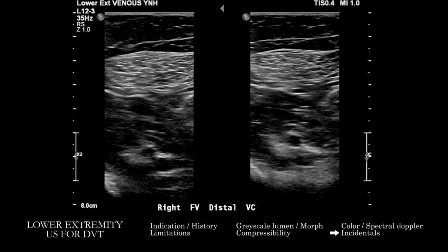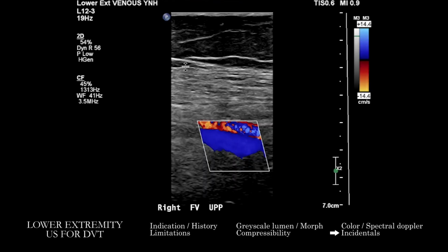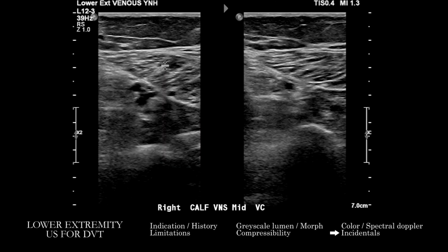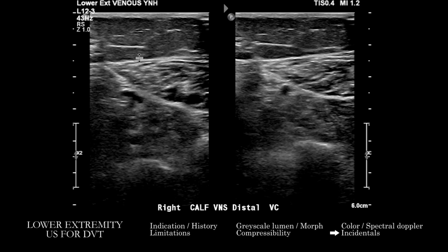In many patients, we'll see an incidental Baker cyst in the popliteal fossa, and make sure we're throwing color Doppler on it or any sort of finding as well. Things you may see include incidental lymph nodes, adenopathy, edema in the lower extremity. You can see vascular abnormalities, collections, things like this. Every once in a while, you'll see something more explanatory for the patient's presentation than an actual venous abnormality.